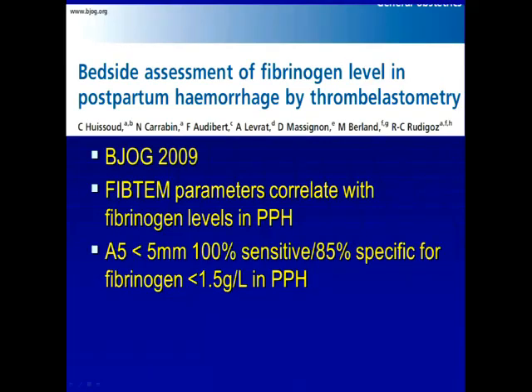They always want data. So, well, here we've done a local trial, allow us to use it in an evaluative way, for research, until we actually get to the official channels, because it is tremendously helpful as far as their cardiac team goes. You get very, I think, indirect evidence from the ROTEM. I'm not sure what the other cardiac guys in the room think.